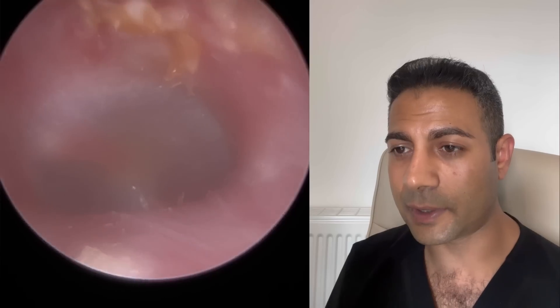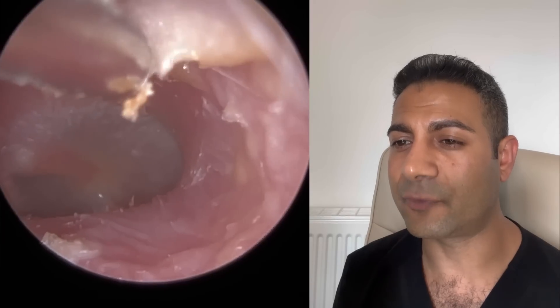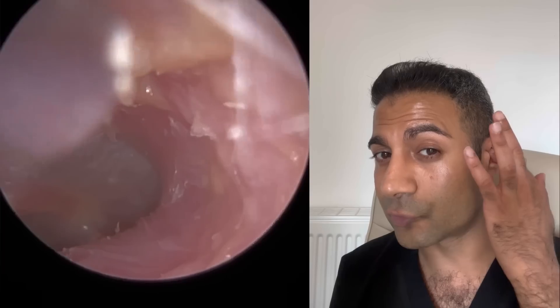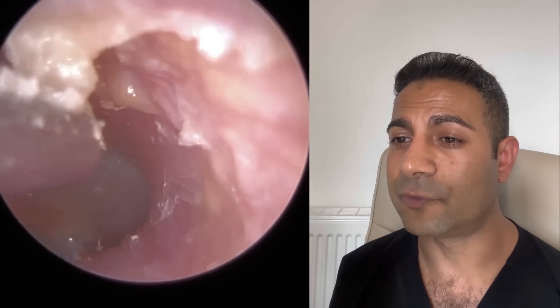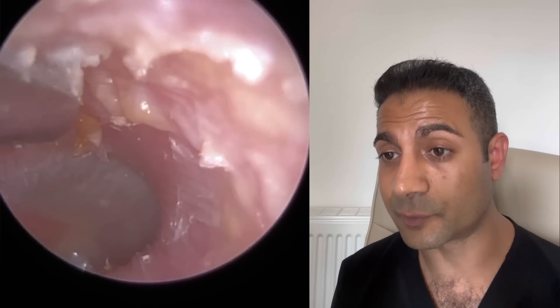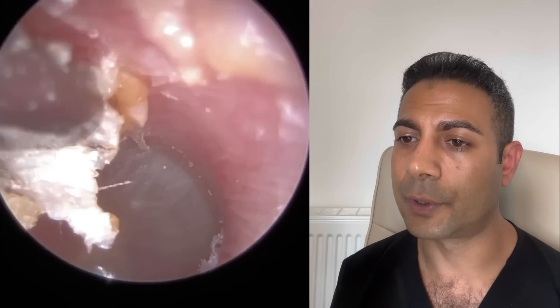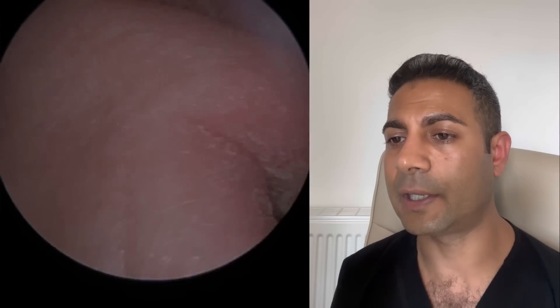I've more or less cleared the bulk of the debris, but I'm just going to go around now and remove as much macerated skin off the canal wall as possible. You may have noticed that just before I went into the ear, the entire concha bowl was really dry and cracked, and so was the entrance. Hopefully this patient can get treated. This layer of skin came from nowhere actually — it wasn't really visible until I grabbed the tail end of the skin and as I started peeling it, it was a thick layer, which is a pleasant surprise.